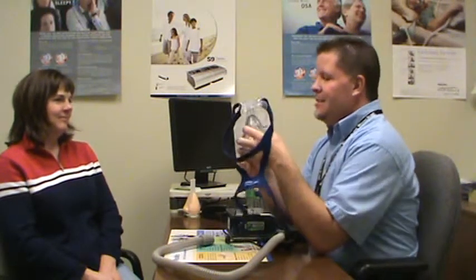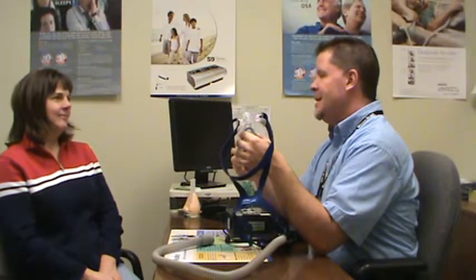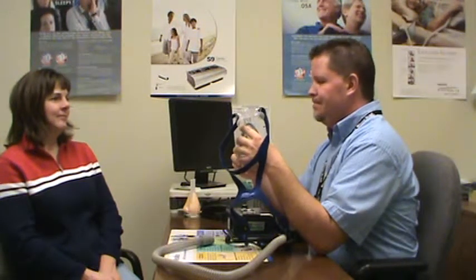The reason the sleep study suggested this mask for you is because it's a full face mask. It covers both the nose and the mouth. It allows you to breathe through either, whatever's most comfortable. You don't have to worry about your mouth popping open or a stuffy nose, which is a nice option. There's a few things about this mask that I'd like you to know.